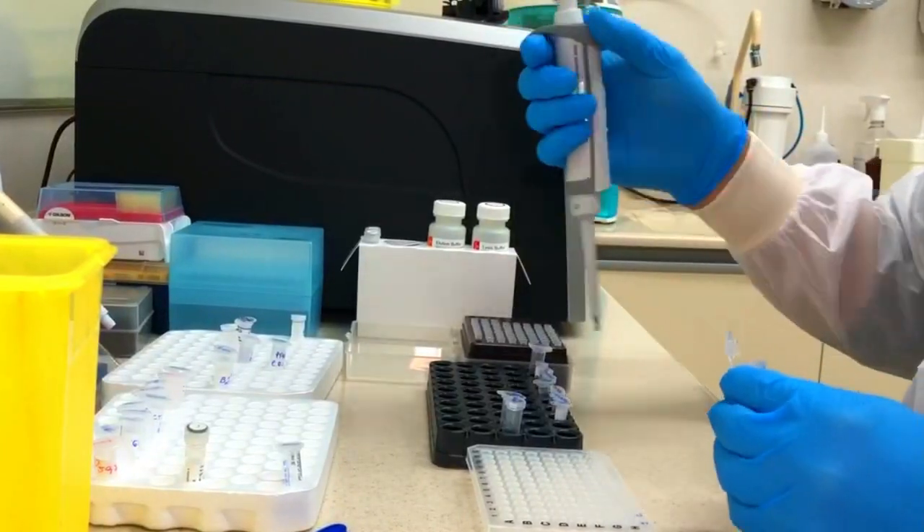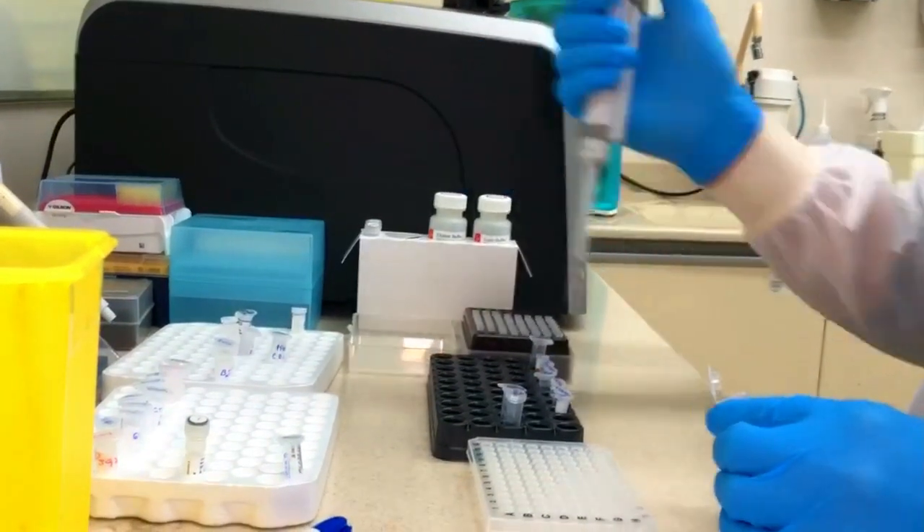Don't you believe we can perform a high-resolution HLA test in less than five hours from sample to results? I will show it to you now. You will see the protocol for one sample from beginning to end as it was developed by Omixon. Let's go — to start the protocol, you need to dilute your DNA sample to a concentration of 20 nanograms per microliter.